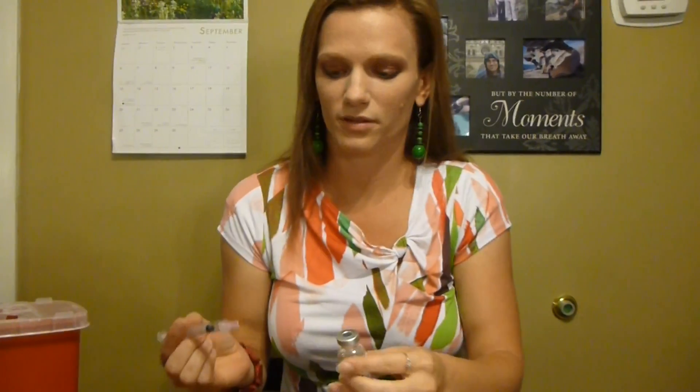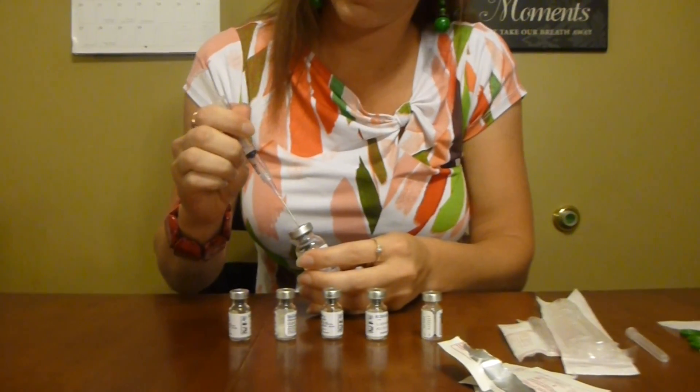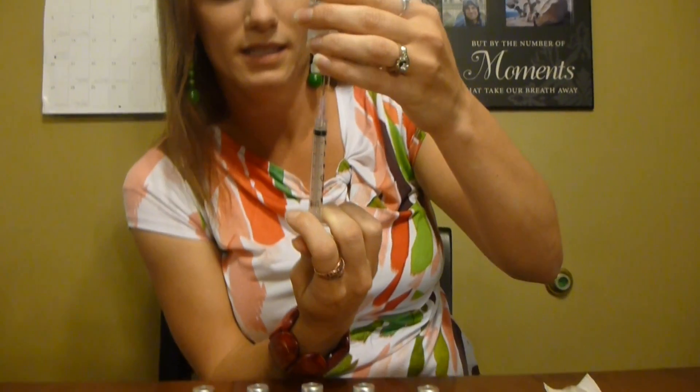So this is what I'm going to be using to draw everything out. It's a really big fat scary needle — I will not be using this on myself. This just makes it easier to draw everything out. What I need to do first is get a little bit of air in there; it gets hard to pull things out if you don't push some air in first. So I inject the air in and I turn this upside down so that it just draws right in.